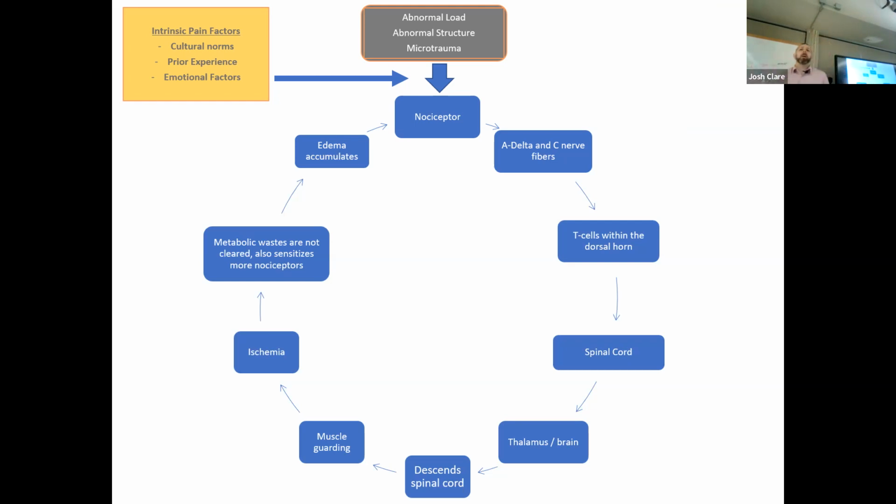Now, the great thing about this too is I could stay very superficial as long as I'm in contact, I'm doing the job. Or I can drive a little bit more pressure with it. And now I'm even introducing more of that non-painful stimulus, using this almost like a massage technique. And once we do massage techniques, you can say, okay, is there a specific technique I can also use with this? So that's what that is.